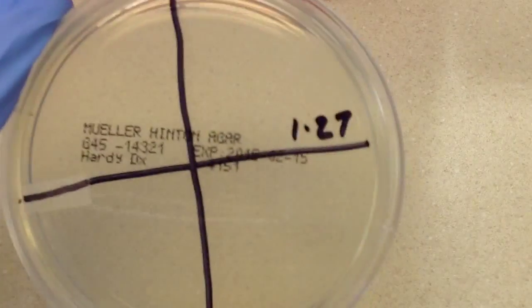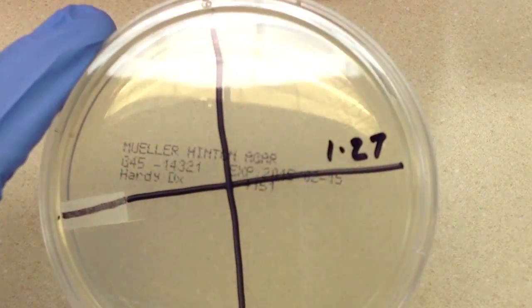In this video we are going to set up an X and V plate for Haemophilus identification. So the first thing that we'll do here, well the first thing that I've done is I've taken a Mueller Hinton plate.